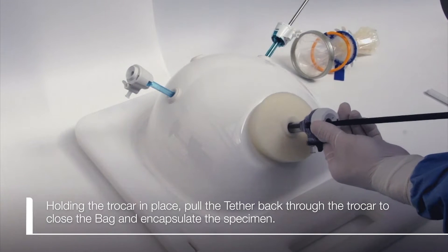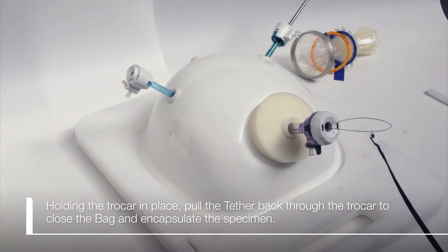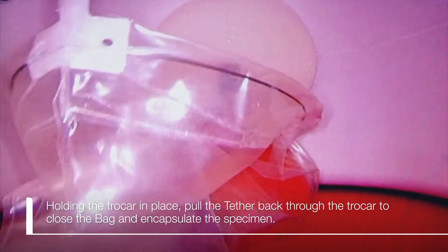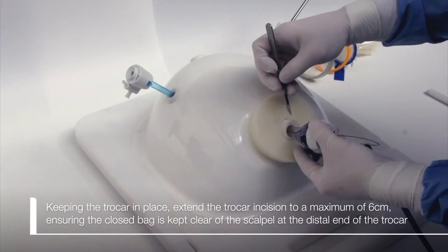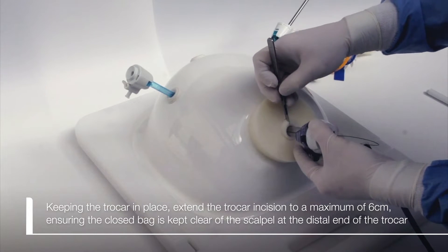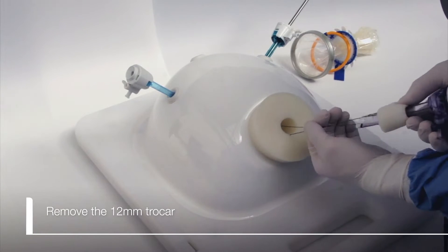Holding the trocar in place, pull the tether back through the trocar to close the bag and encapsulate the specimen. Keeping the trocar in place, extend the trocar incision to a maximum of six centimeters, ensuring the closed bag is kept clear of the scalpel at the distal end of the trocar, and then remove the 12 millimeter trocar.